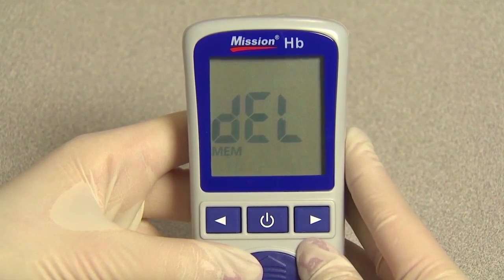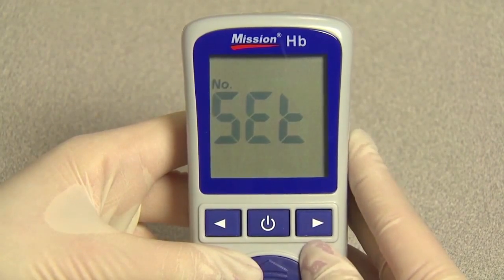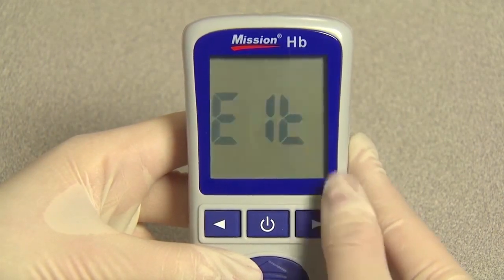MEM will be displayed. Press the power button to delete all the data in memory, then the meter returns to the setup menu. Press right or left until ELT is displayed, and press power button to exit the setup menu.